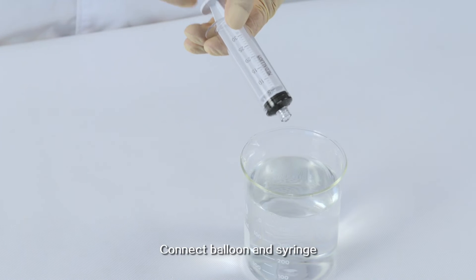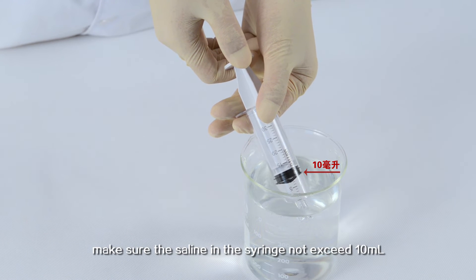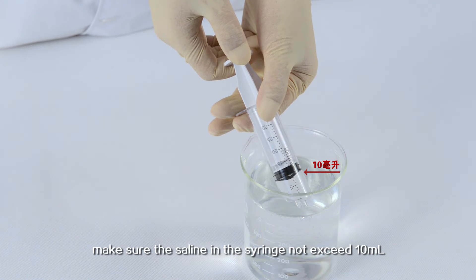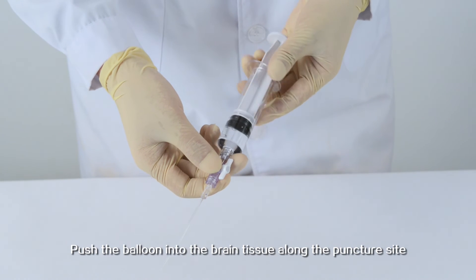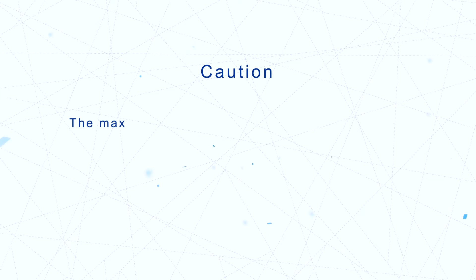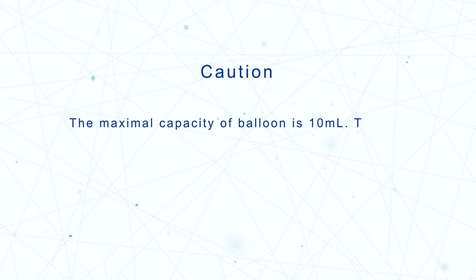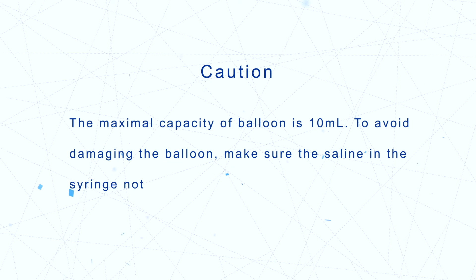Connect the balloon and syringe, making sure the saline in the syringe does not exceed 10 ml. Push the balloon into the brain tissue along the puncture site. CAUTION: The maximal capacity of the balloon is 10 ml; to avoid damaging the balloon, ensure the saline in the syringe does not exceed 10 ml.